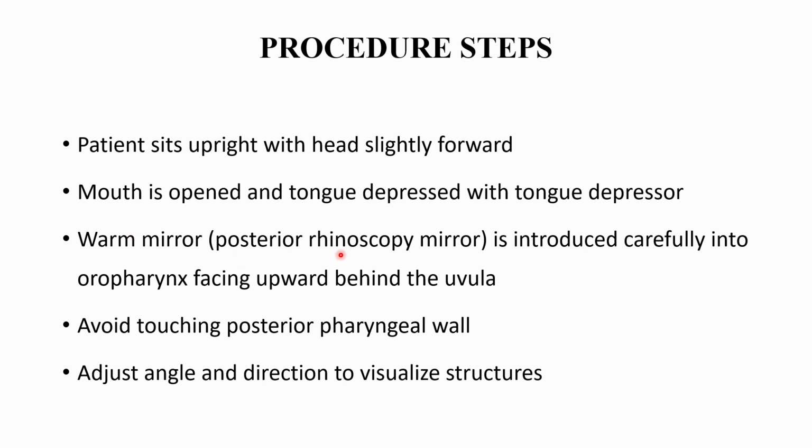Warm the posterior rhinoscopy mirror, after checking first on yourself and then on the patient. If the patient is satisfied with the warmth, then it is introduced carefully into the oropharynx, behind the uvula, facing upwards. Do avoid touching the posterior pharyngeal wall, otherwise it will induce the gag reflex, and adjust the angle and direction on both sides a little back to visualize the structures.